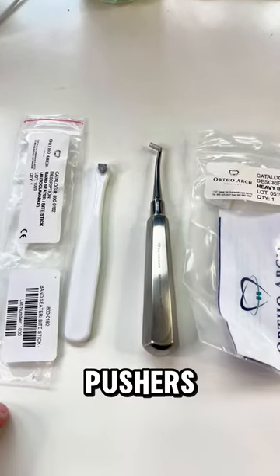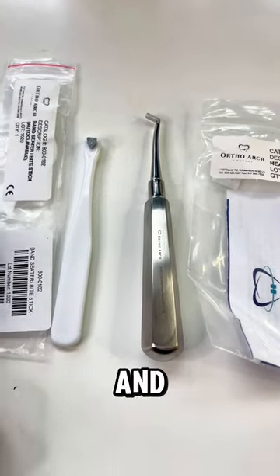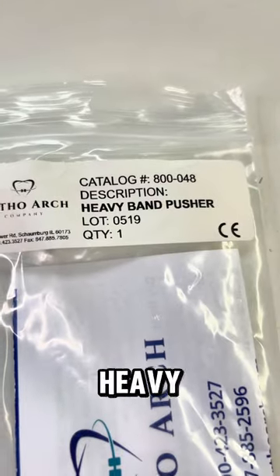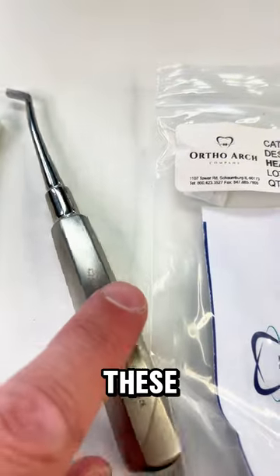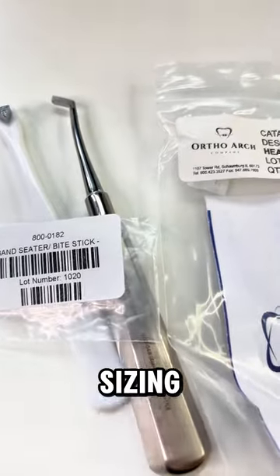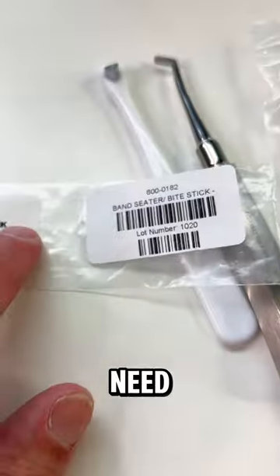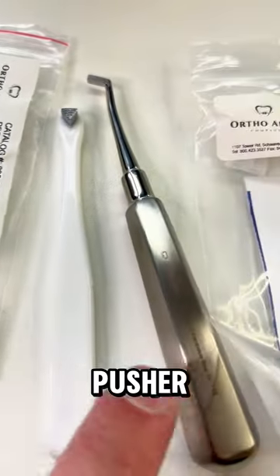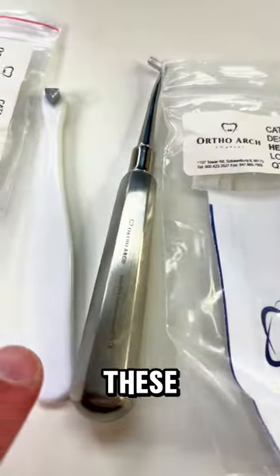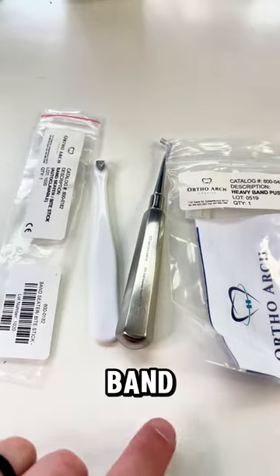You will need band pushers for band sizing the typodont. There are two types: the heavy band pusher — a beefy, heavy-duty instrument — and a bite stick band seater. You're going to need one of each. Both of these are used for the band sizing exercise on the typodont.